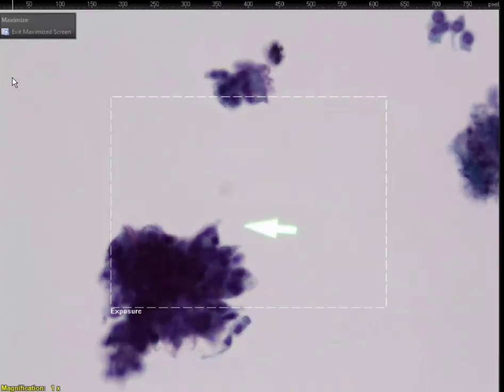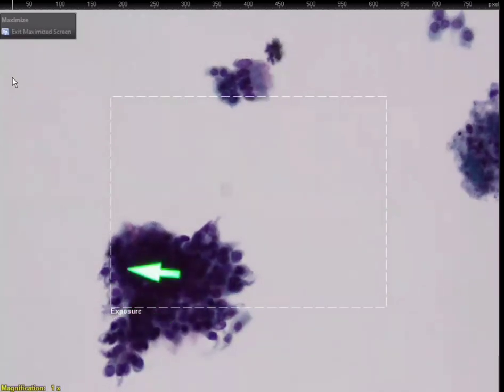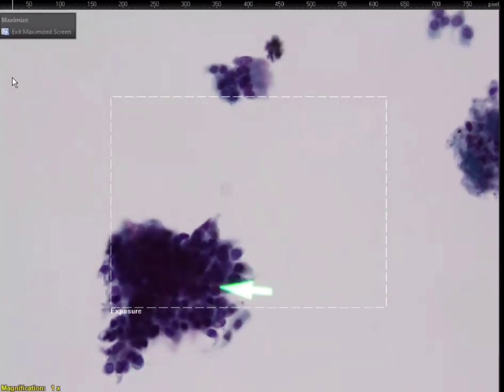Have some cilia on the top one. Yeah, and on the top, there's a terminal bar down here, cilia up here. See that? So even though they look so dark and dense and whatnot, I'm seeing terminal bars and cilia. These are probably just sitting on their side because it's packed so much one on top of another. It looks really dark. But if I look at individual nuclei, you see they all look about the same. Yes. Yeah, in here, can you see?